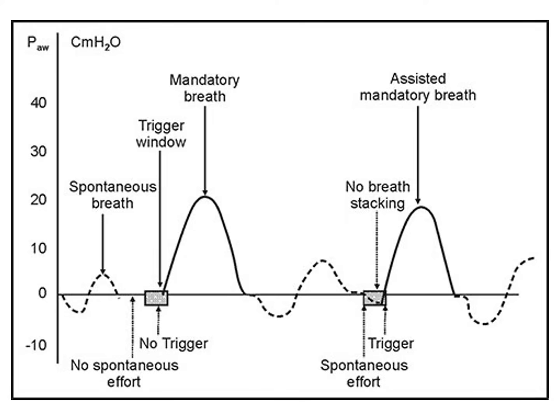Just to remind you, I'm not going to get into this in any depth, but here there is spontaneous breathing, which are those dotted lines, and you're seeing the pressure go negative as the patient takes a breath in, and then positive as they breathe out. And then you get a mandatory breath, which is a solid line, and there was no trigger. So that was the ventilator just delivering a breath. Nothing made the ventilator synchronize it.